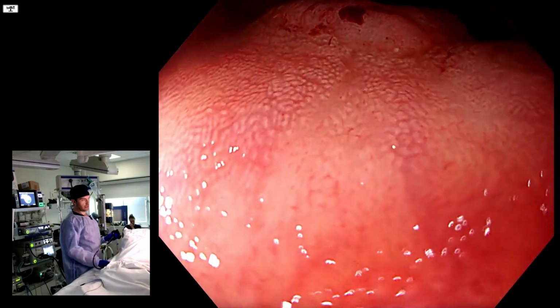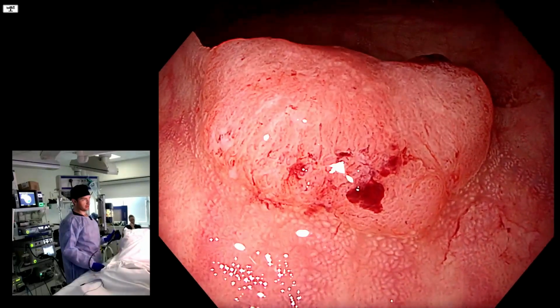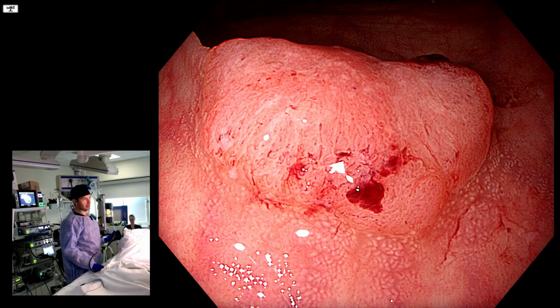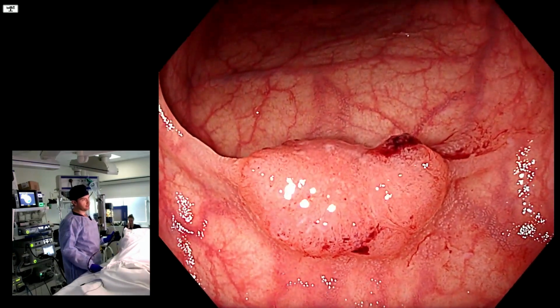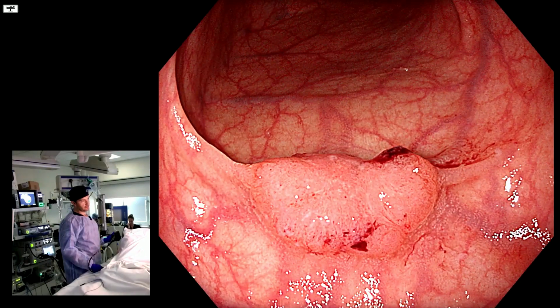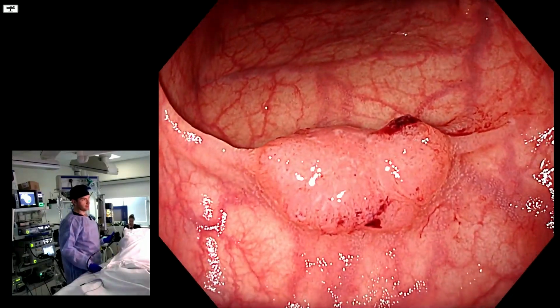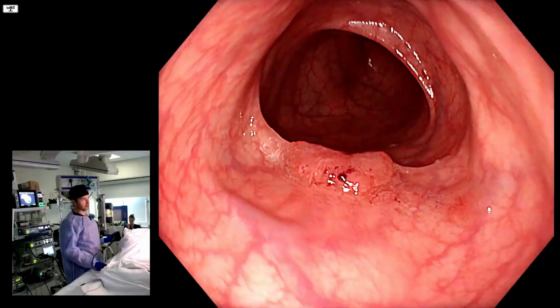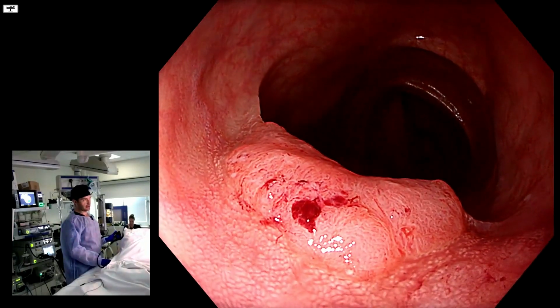Then extra redness. So it does also apply in virtual chromoendoscopy, but if we just come back on this polyp and I try and stabilize it, you can kind of appreciate that the center of the polyp is maybe more red in a kind of arc than the rest of the polyp. So maybe this is extra redness within the polyp. And then you do have convergence of a fold into this polyp. Like you see the fold now from left to right is kind of converging within the thing. Is this fold deformation? Is this a depression? I'm not sure this has a true depression in it, this polyp. So potentially we are talking about fold deformation. But anyway, we have got more than 2, definitely, of the 6 blink features.